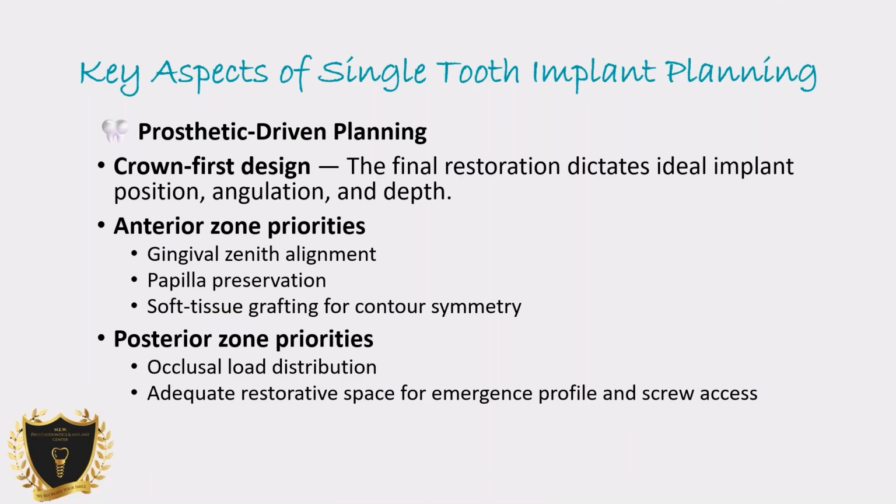Another thing is, where do you want your emergence profile? Where do you want your access hole? So whether you're doing cement or screw retained.